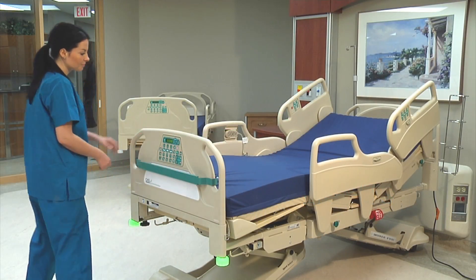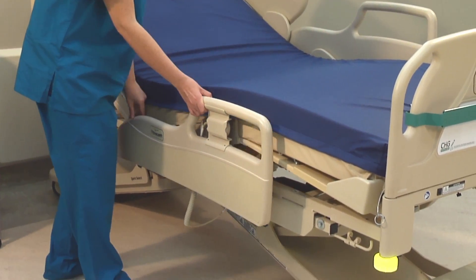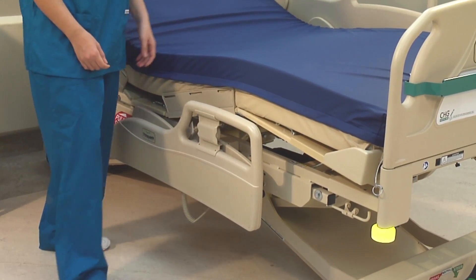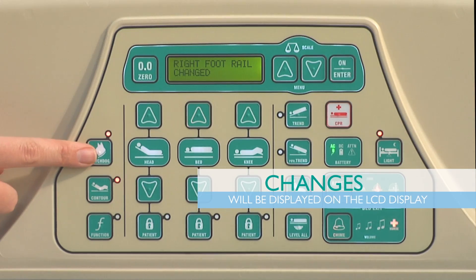Any change to the bed from this point forward will be indicated by the Watchdog lights turning yellow. To identify what has changed, press the Watchdog button. Changes will be displayed on the LCD display.